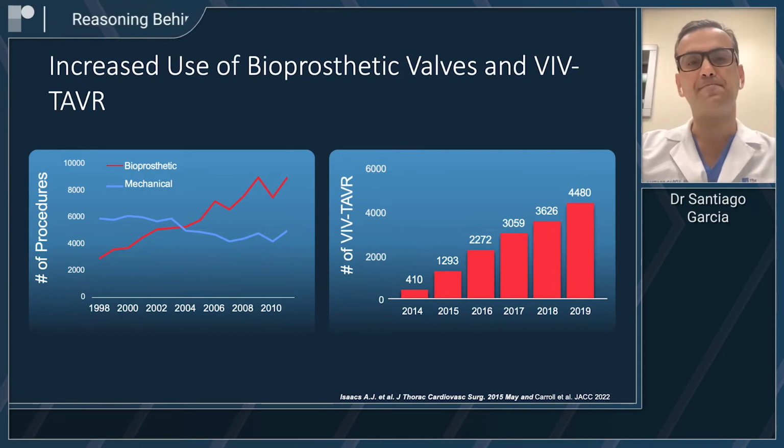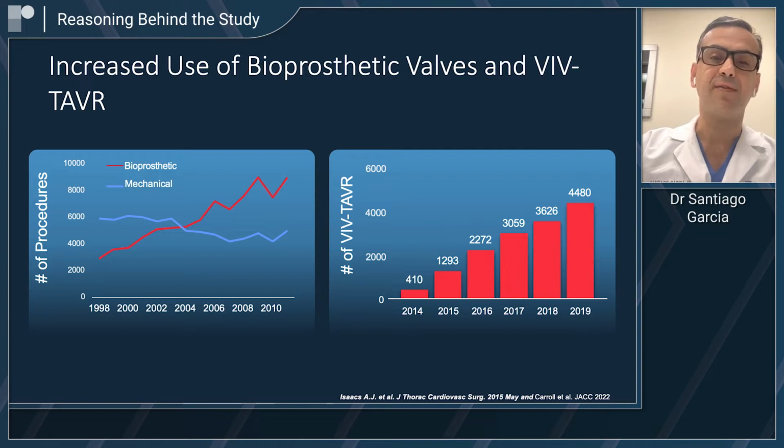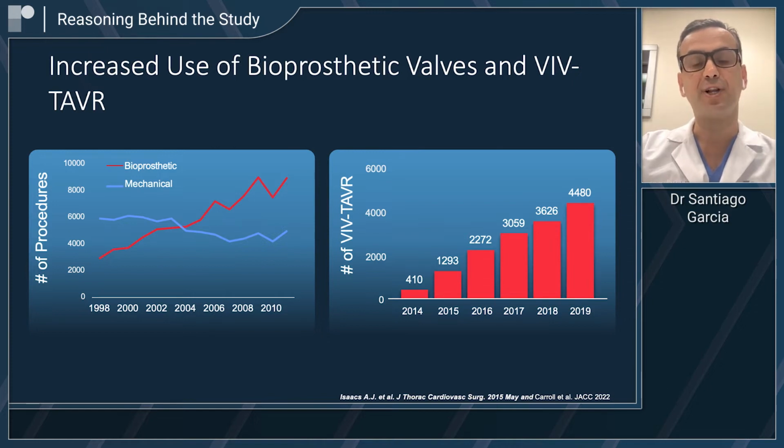Well, these procedures, as you know, the use of bioprosthetic valves has increased not only in the United States, but also around the world. And the rationale for that is that patients and doctors wanted to avoid, if at all possible, the risk of long-term anticoagulation that is associated with the use of mechanical valves. However, the downside of bioprosthetic valves is that eventually all of them will degenerate and there will be a need for a second procedure. A valve-in-valve transcatheter aortic valve replacement has emerged as a very reasonable alternative to redo surgery and is increasingly used in the US to treat degenerated surgical valves.